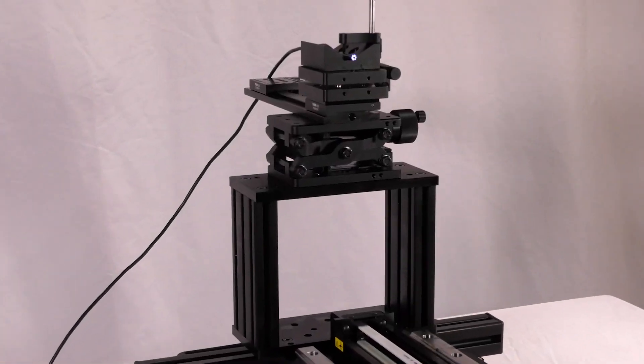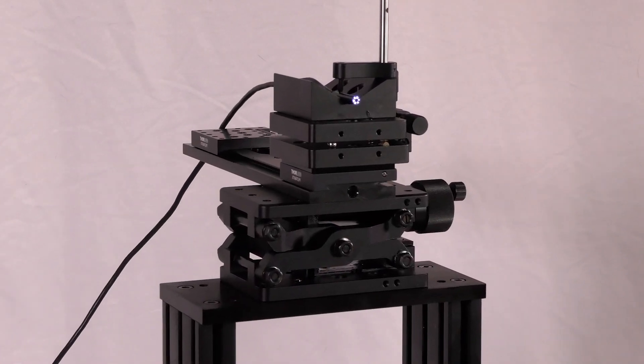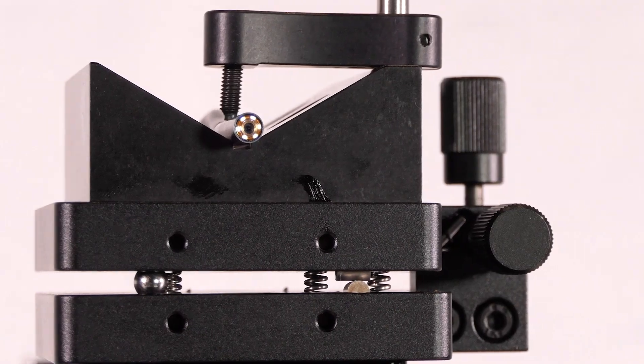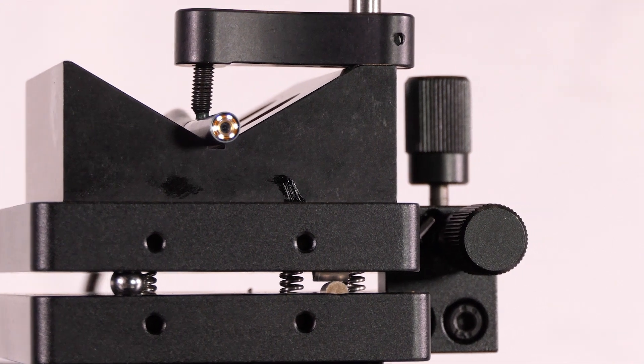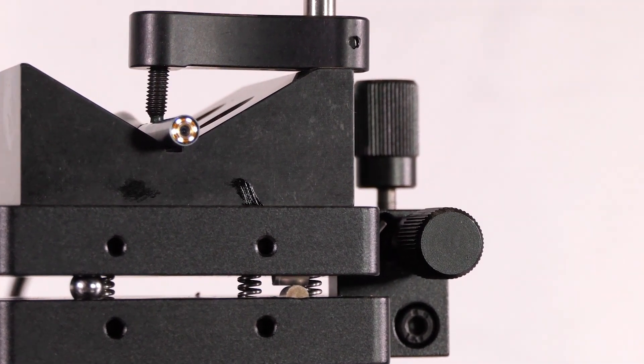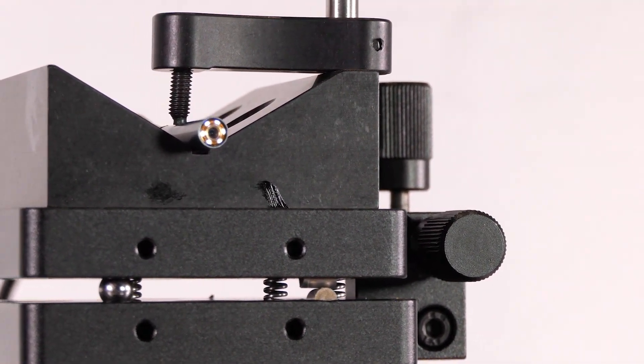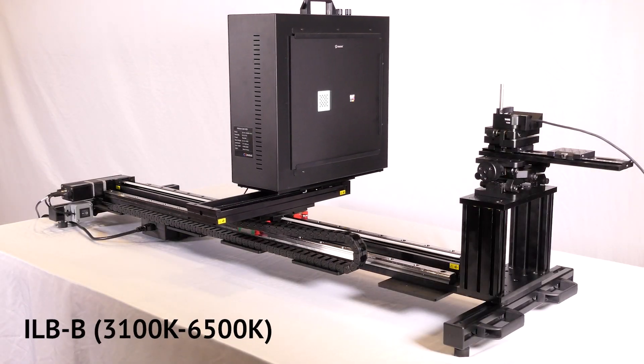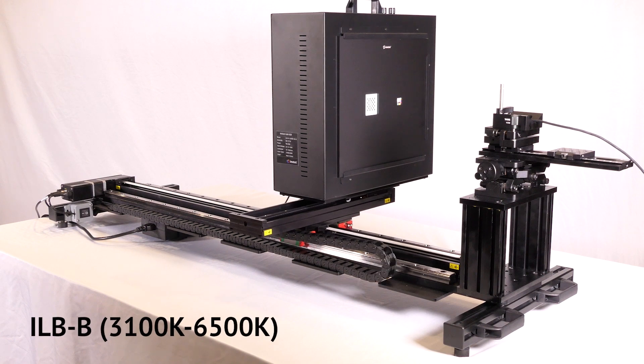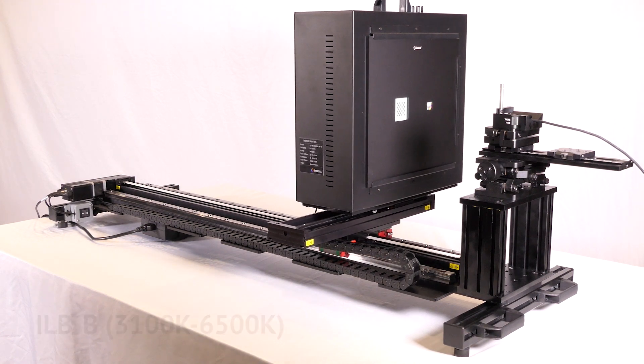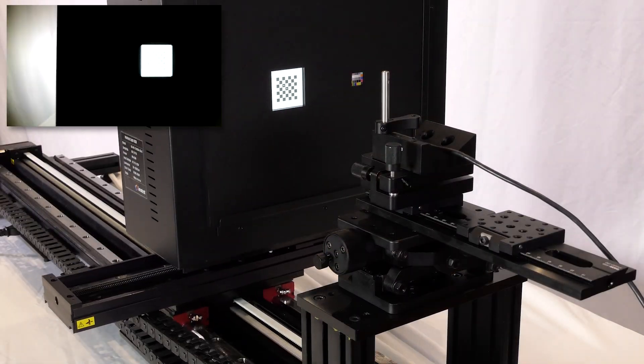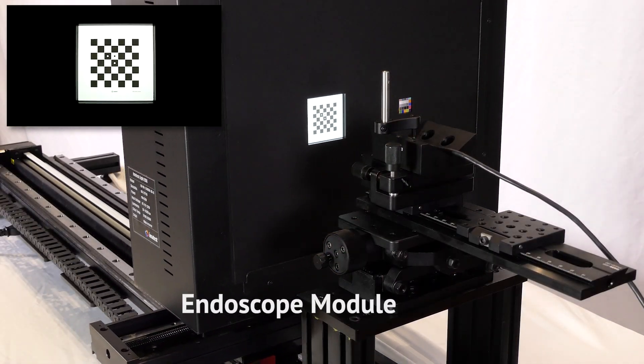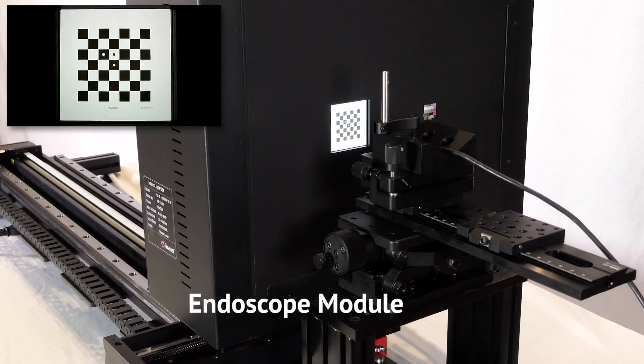The BTS significantly reduces the amount of space and time needed in your lab. Quickly test endoscopes and medical devices for sharpness, color accuracy, and more using the Endoscope module.